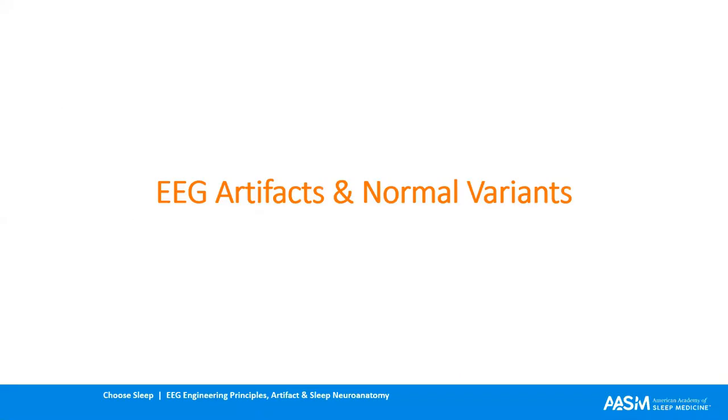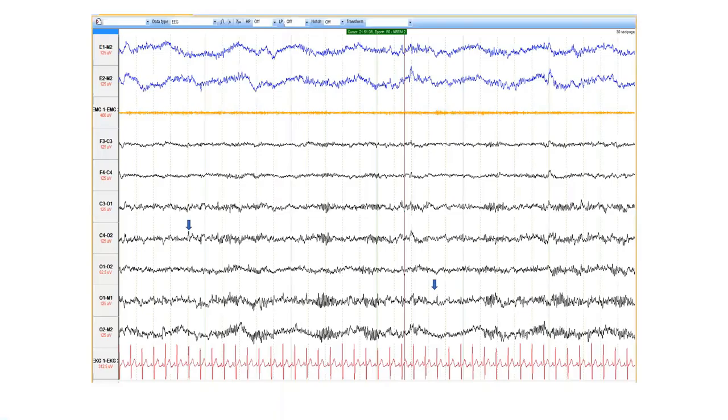All right, so we got through the neuroanatomy part of the talk. We'll talk a little bit about EEG artifacts and normal variants. I want to draw your attention to the arrows here, the fact that it is time locked with our EKG.